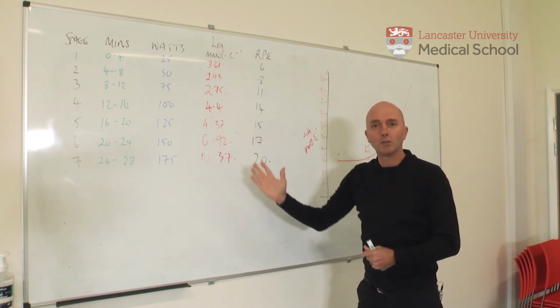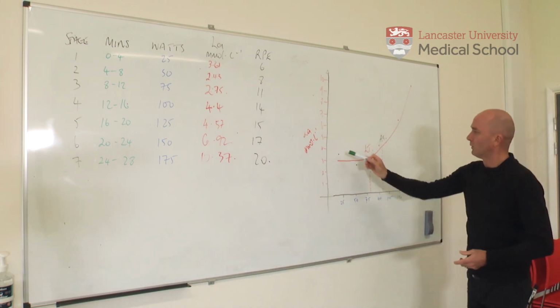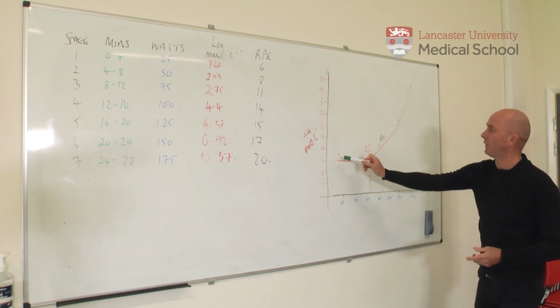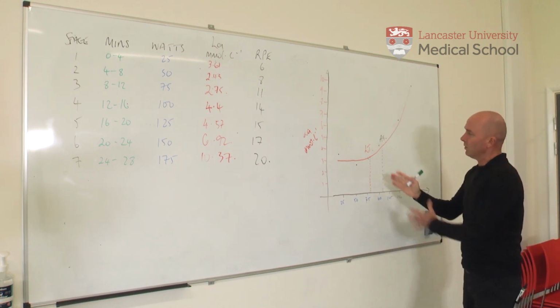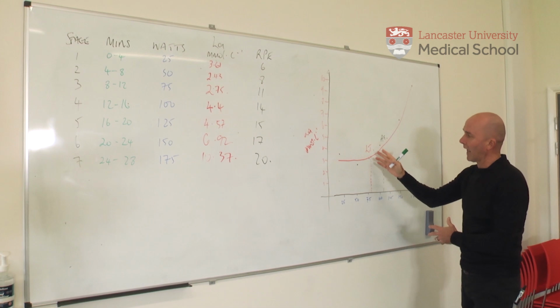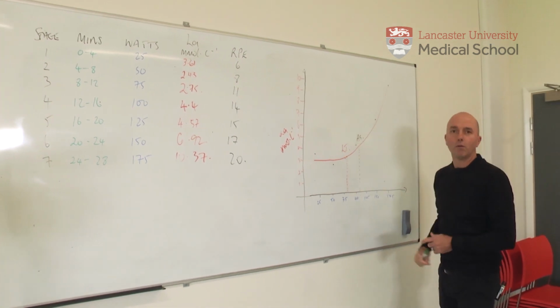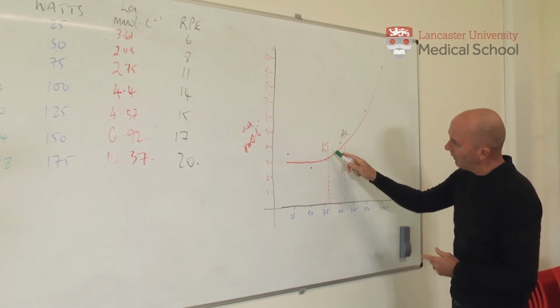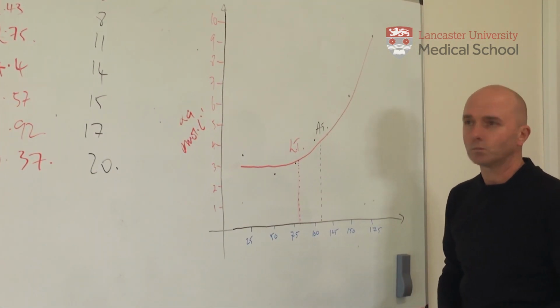So we've got to note down what the data is, and we've got to try and fit the curve as best we can. So we've plotted the data on here, and we've fit the lactate threshold curve. And what we're interested in is lactate threshold. So lactate threshold is this point where lactate starts to rise from above the baseline. And there we could probably work out that it's around about 80 watts.